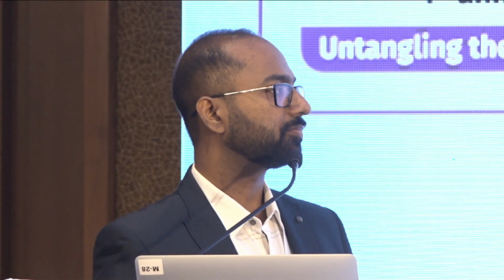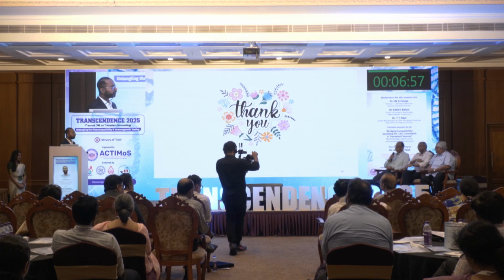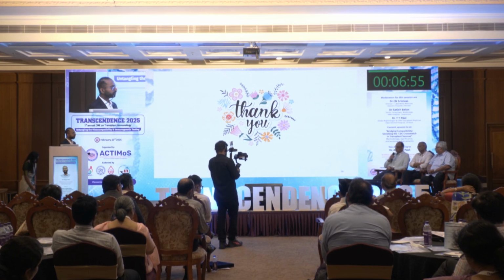Dr. Antonio, that was an excellent presentation. Thank you so much. I have only one question from my side. We were talking about the interferences by therapeutic agents, like rituximab. Do you have any protocols that have been followed in a few papers, using pronase or something to do with anti-rituximab?